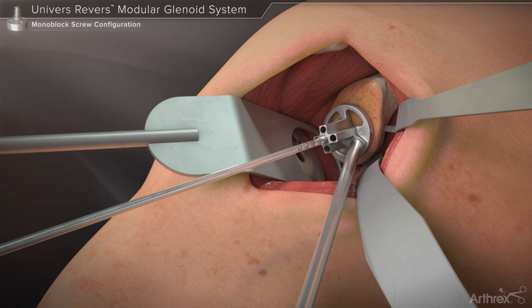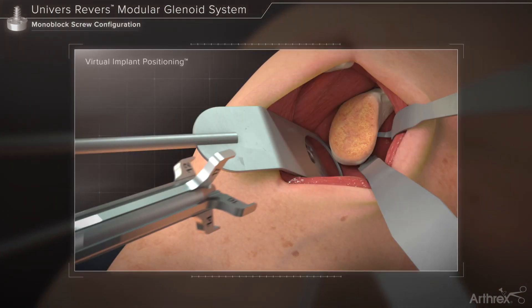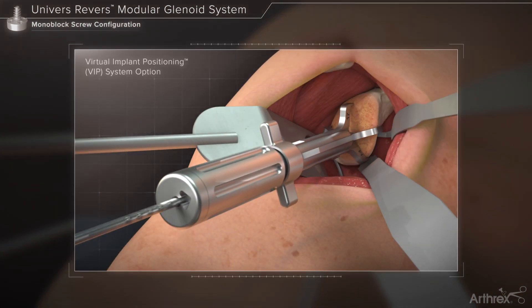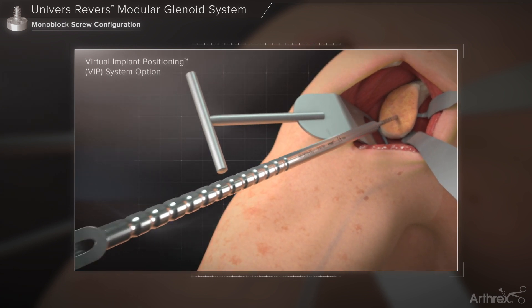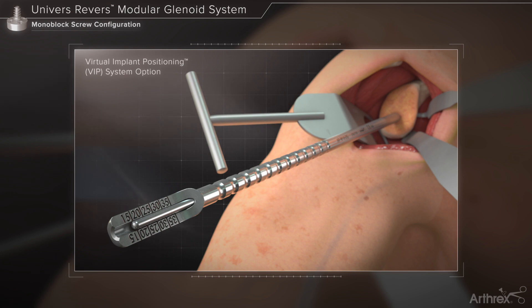A determination of the central screw length can be made by noting the laser marking on the pin shaft. Alternatively, those using the virtual implant positioning system may orient the guide wire using the VIP glenoid targeter for enhanced accuracy. Measurement of the guide wire depth in the glenoid as it relates to central post or screw length may be determined through the use of the guide wire depth gauge.